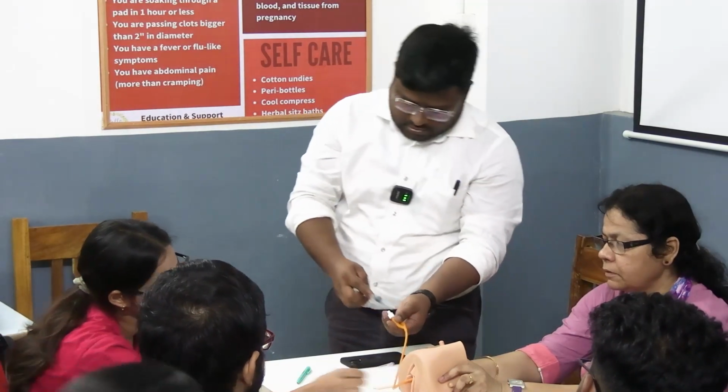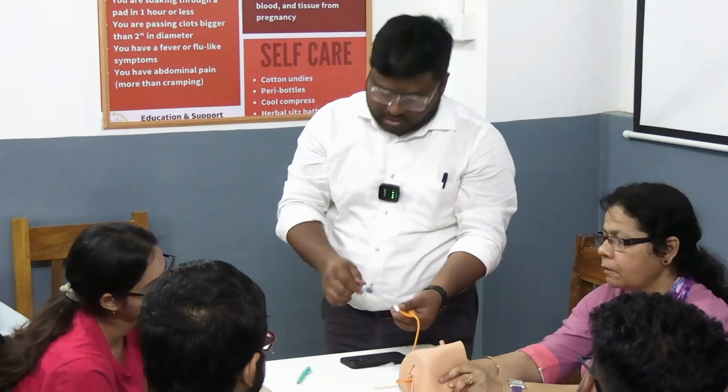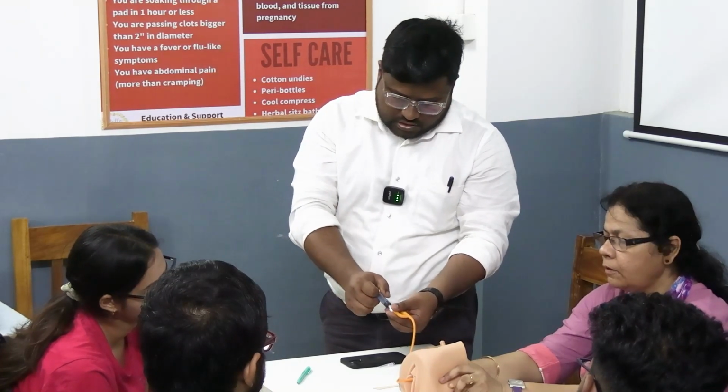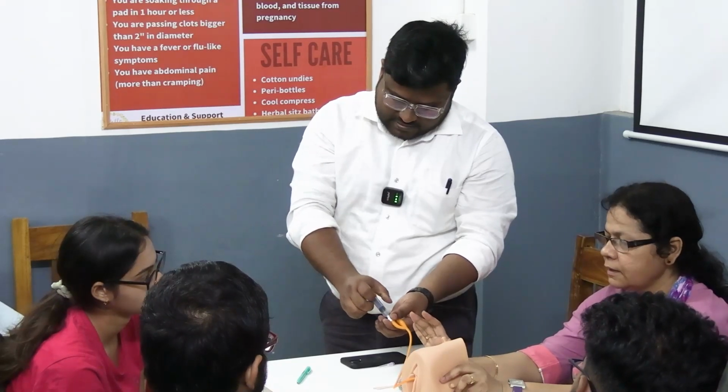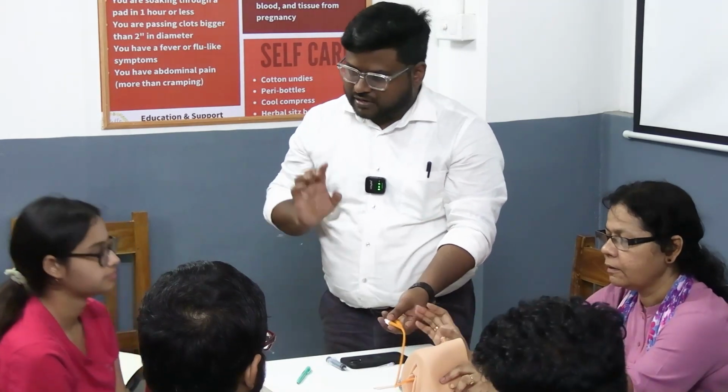This is air, right? This is not water. It comes out naturally. Inflating, okay. Fine, fine, fine. 10. I have inserted 10.